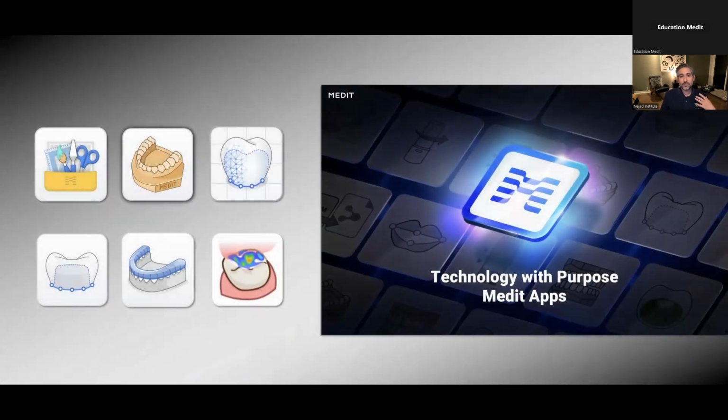And for me, one of those key technologies that brought this all together was when I started using Medit, because I am really a big fan of using different technologies and learning a lot of different things, but the software limitations, the licenses, and so on make it hard for you to invest in something when you're not confident if you're going to implement it.